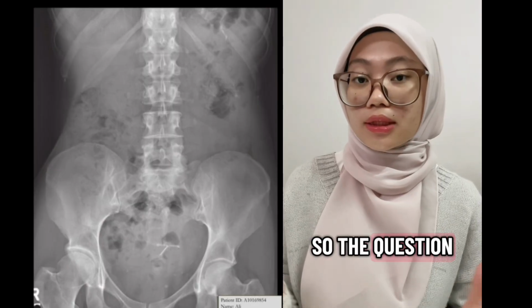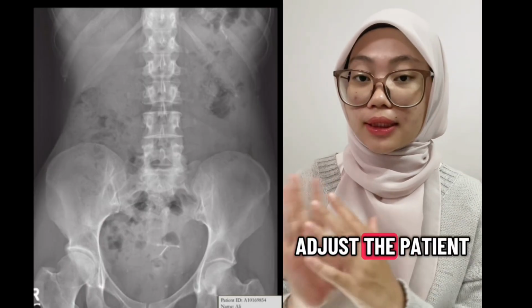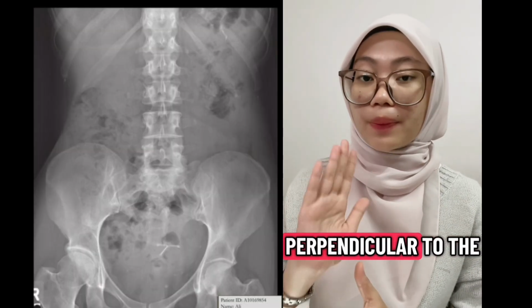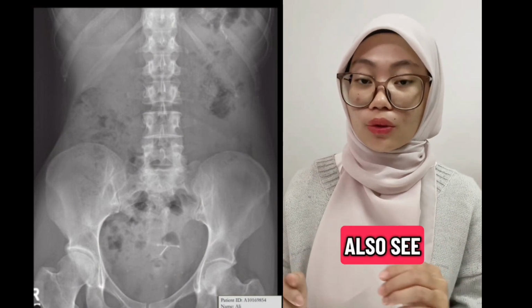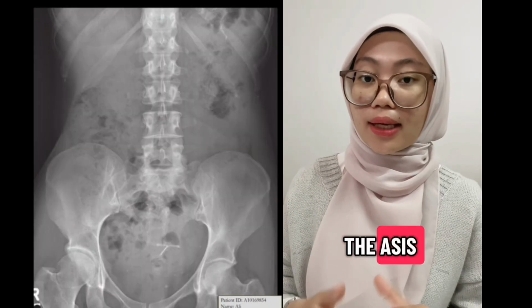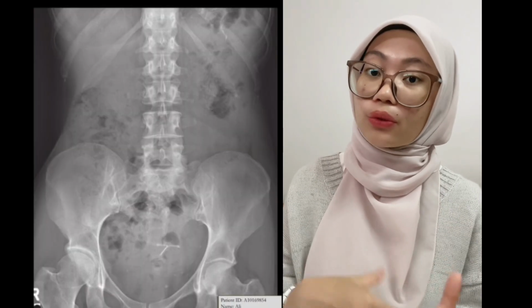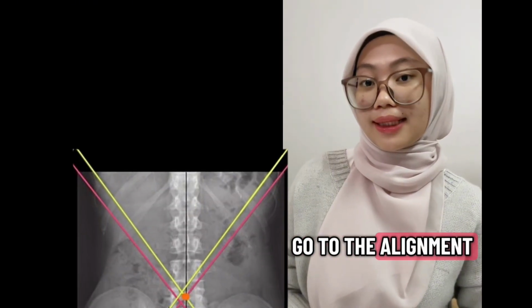So how to improve the positioning? We can adjust the patient until the mid-sagittal plane of the patient is perpendicular to the image receptor, and we can also check the distance between the ASIS and the tabletop of the image receptor if we do it supine.